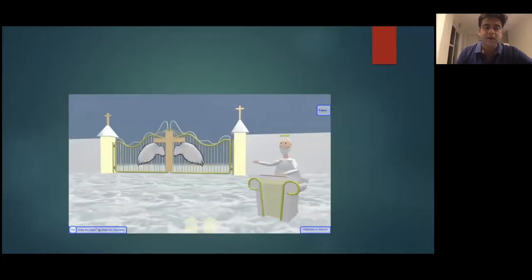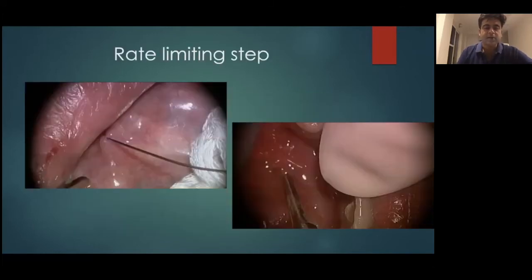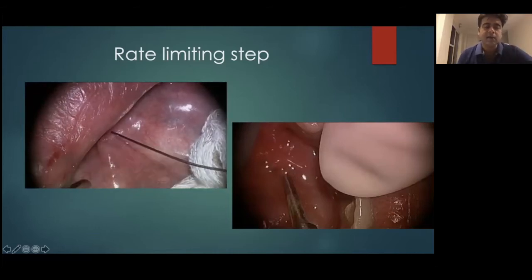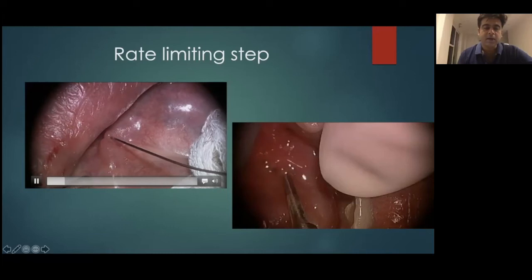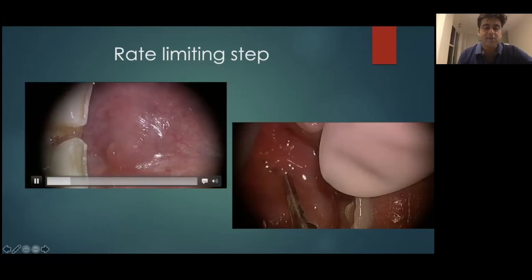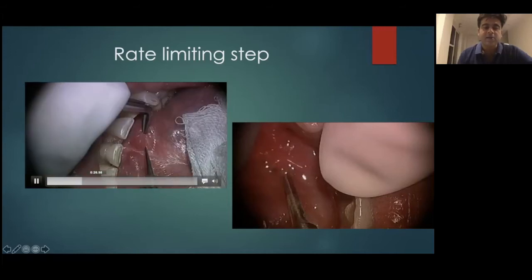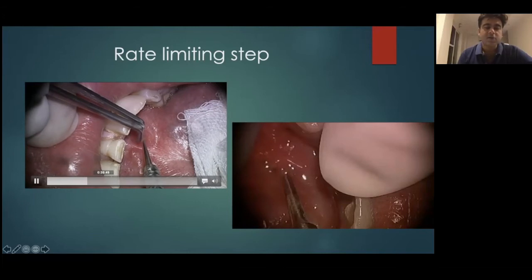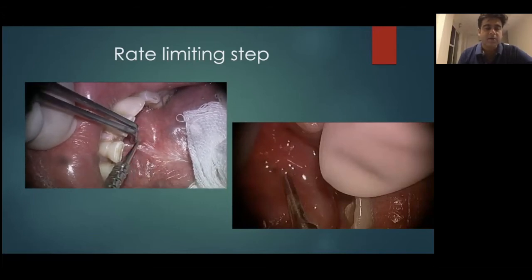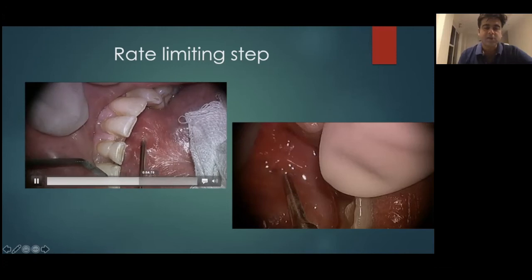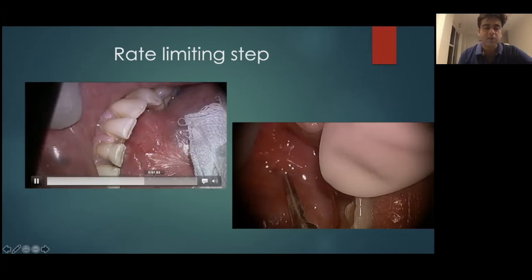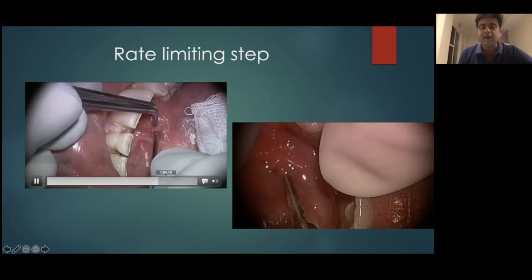For any sialendoscopist, the rate-limiting factor really begins with handling the ductal orifice — the papilla. The submandibular papilla opens on either side of the frenulum in the midline. Magnification really helps because you're able to identify the opening, and you need to be very gentle — any forceful entry can lead to a lot of edema and make identification virtually impossible. Once identified, you serially dilate with various probes and dilators until the opening is dilated enough to introduce the endoscope.